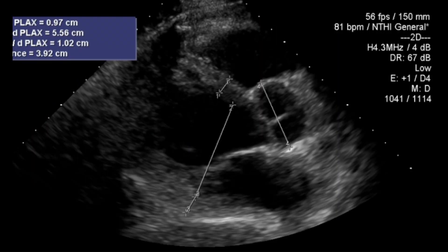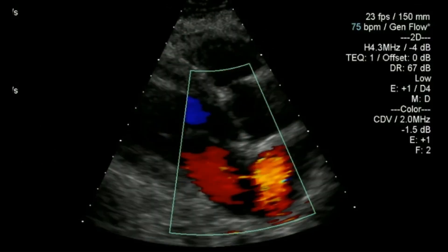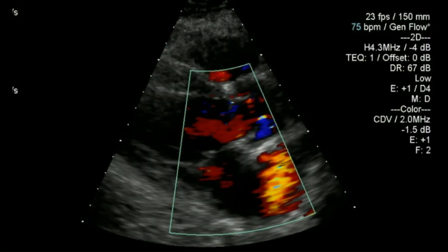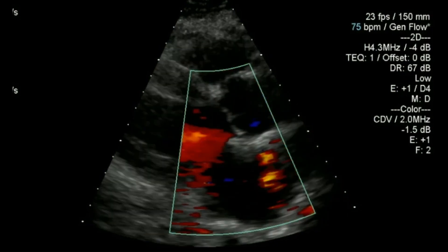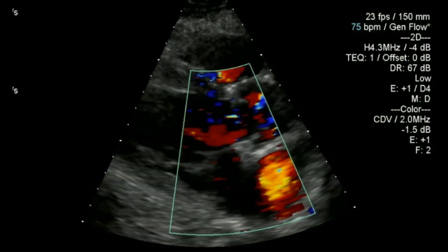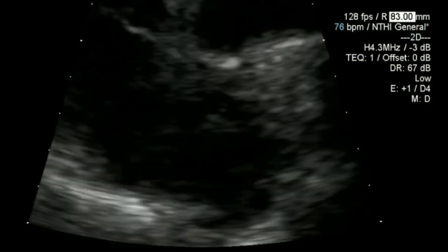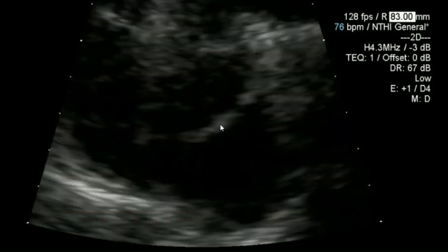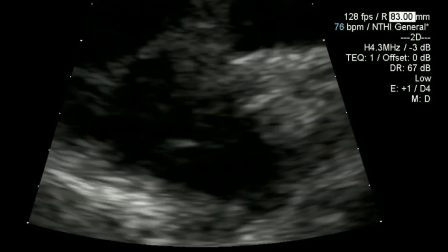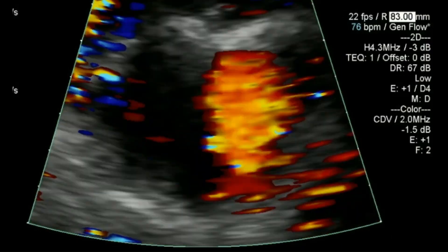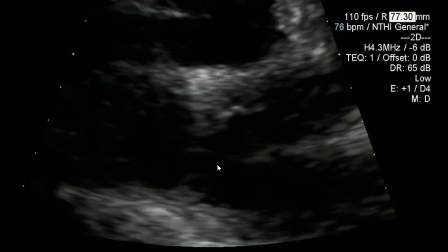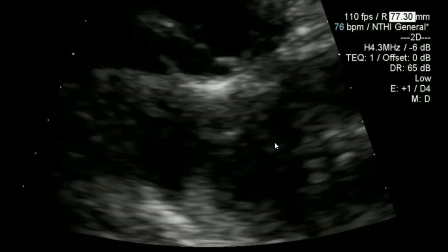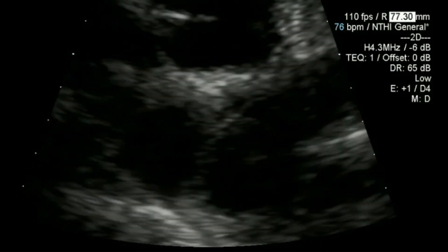The wall thicknesses and chamber sizes seem OK. When you look at the colour flow, you do see a relatively abnormal appearance with an apparent dominant flow in one area and some flow elsewhere. When you zoom in, the membrane does become more apparent, and similarly with colour flow. Looking in short axis, we can see the membrane moving across, being quite mobile and flexible.